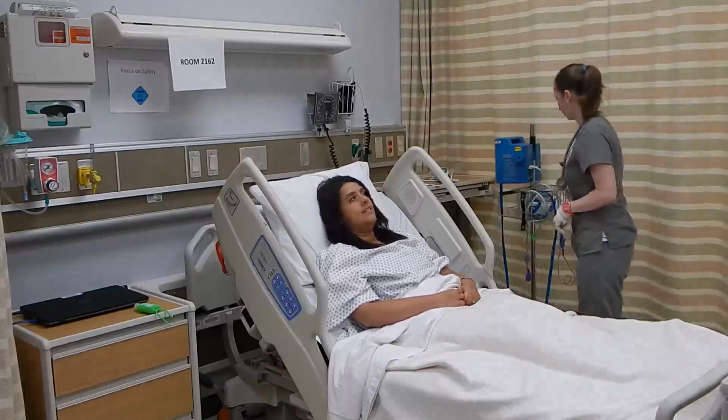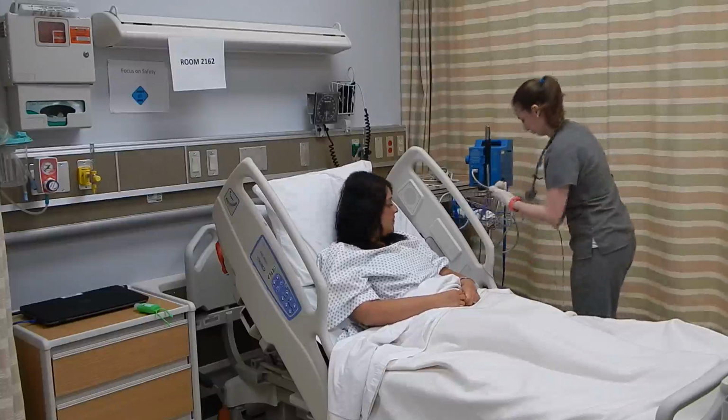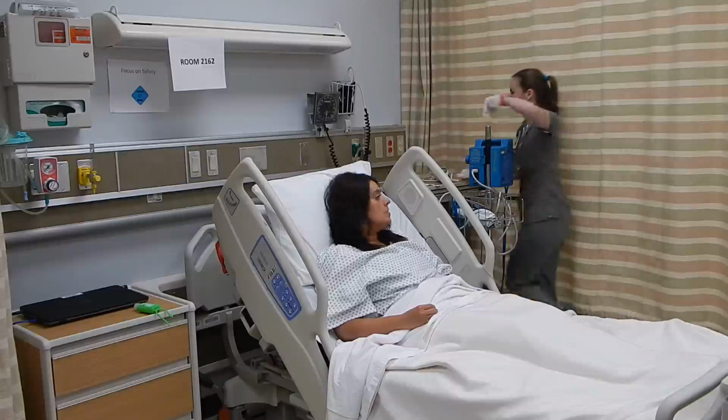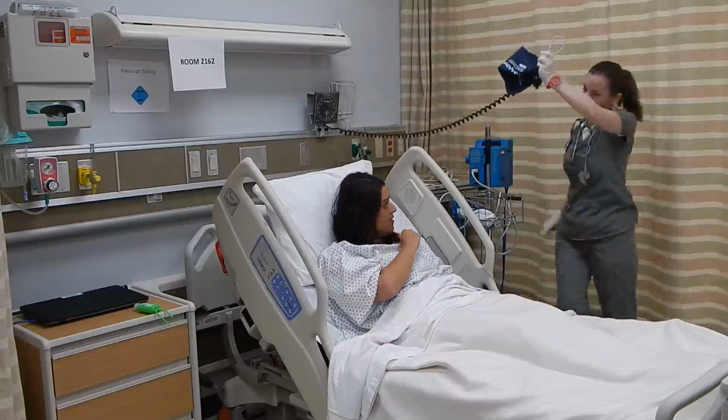Wonderful. Obtain vital signs. I have to get your vital signs: blood pressure, heart rate, respiratory rate, temperature, oxygen saturation, and pain. For video purposes, we will not check the heart rate or respiratory rate for a full minute.